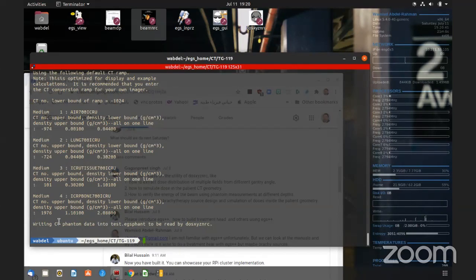And then we could, for example, have titanium or metal, for example, that we take from there up to a different value. Okay, this is different. This is the big advantage. This is the main advantage of Monte Carlo for heterogeneity corrections. In most treatment planning systems, heterogeneity corrections or the dose is actually reported to water. Okay, it's not lung tissue, the doses are reported to water.